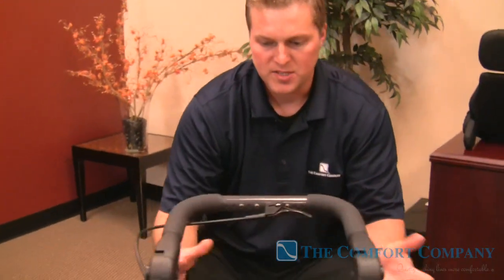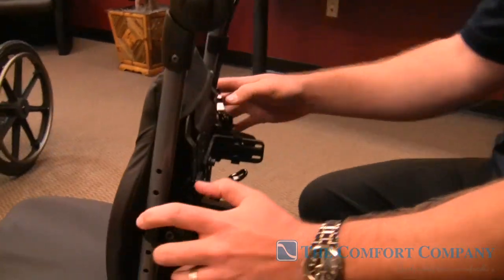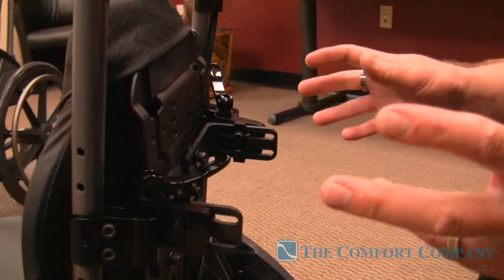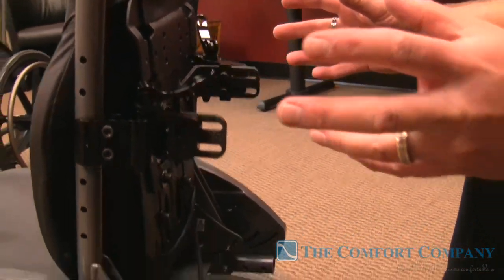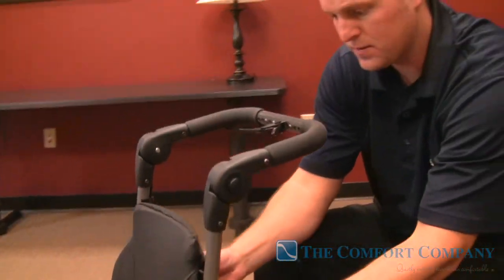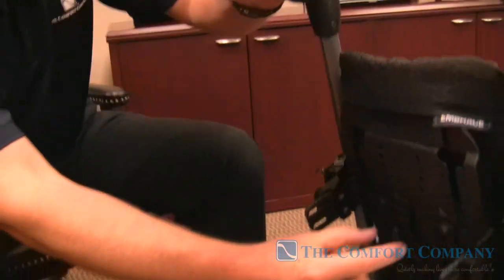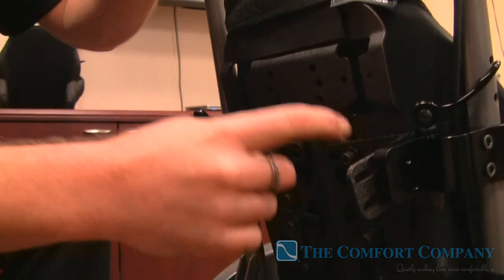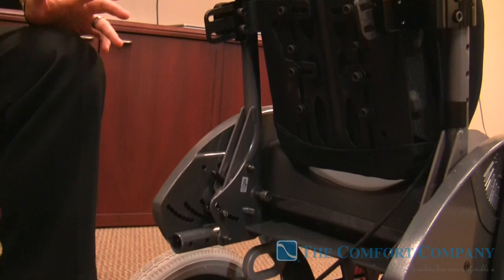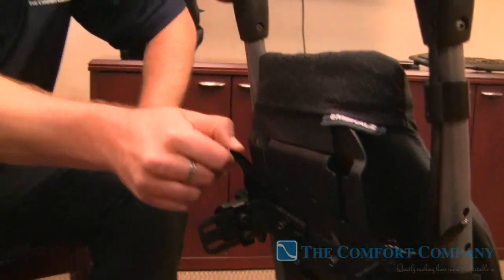There's no messing around with anything. I can have these receivers in different angles and still be able to get there — that's one great thing about the compass hardware. The compass hardware allows you to take this 12-inch back and grow it to a 14-inch. Coming around the back, you can see all this room in the brackets to grow it — we can grow it to a 13 and to a 14 wide system.